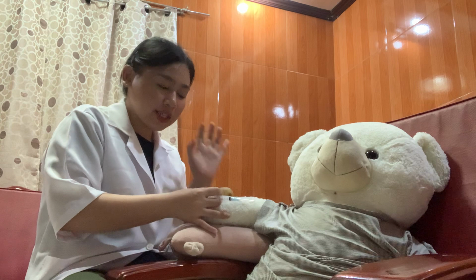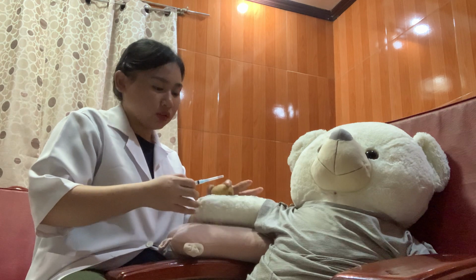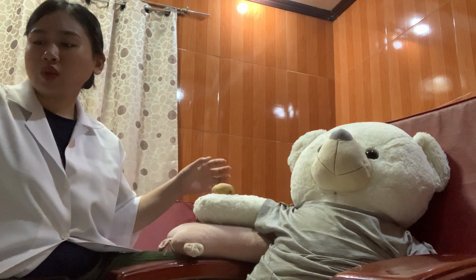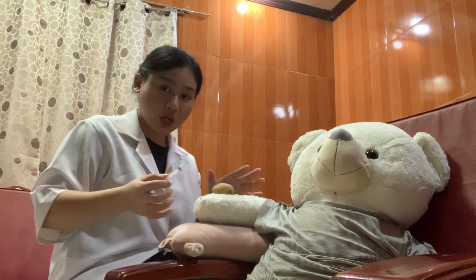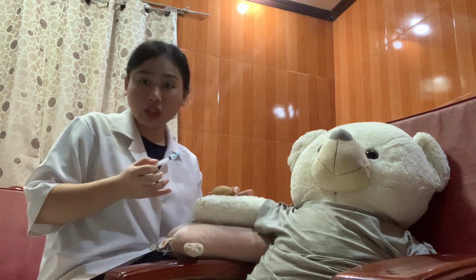Then stabilize the artery by pulling the skin taut. And then we puncture the skin slowly.